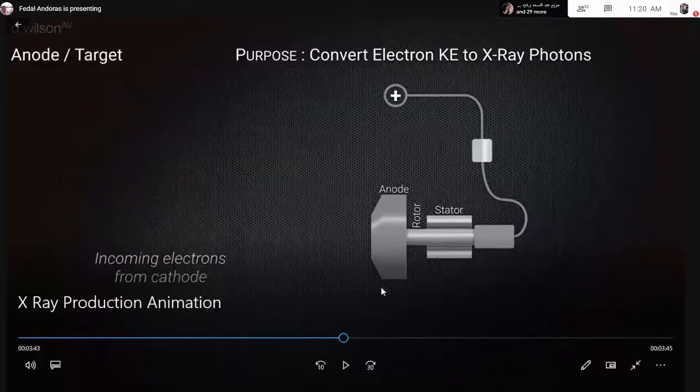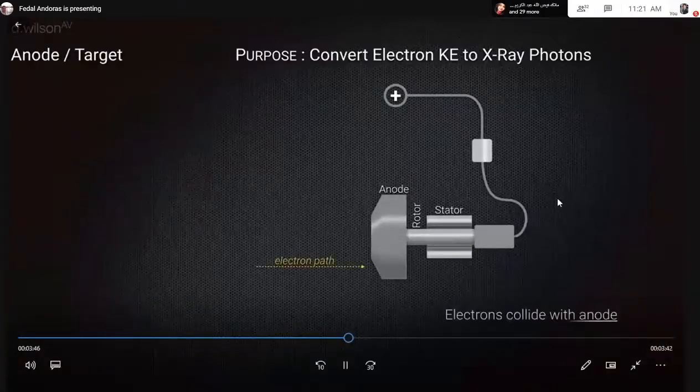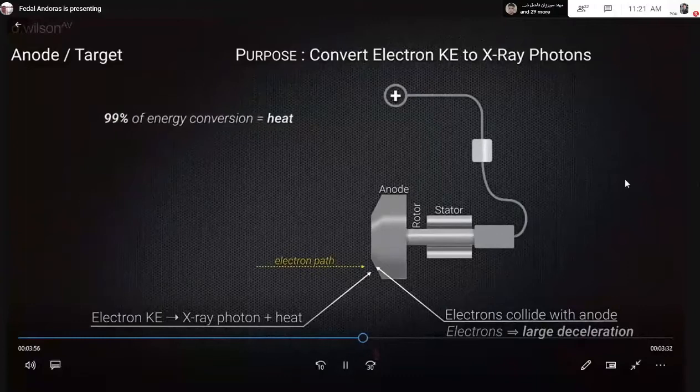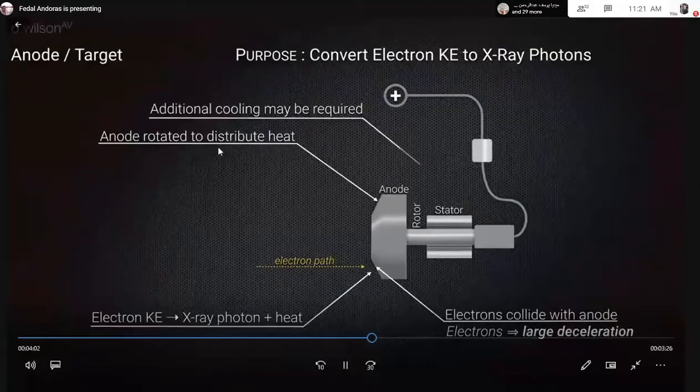But if you have a rotatory anode, one that is always rotating, this type is preferred, because the amount of heat generated while producing X-rays will be distributed over the plate. So just to know, we have two types of anode, stationary fixed and with rotation. The aim is to distribute heat.